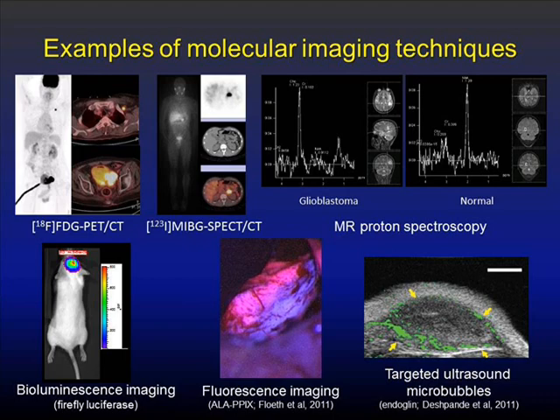You can also do bioluminescence. So this is basically a tumor. It's an experiment from my group just trying to prove that we actually had a tumor in this mouse. But the tumor has firefly luciferase. That's an enzyme that fireflies use to fluoresce. So you can see fireflies because they have this enzyme that creates light. And we can also use that in the laboratory.